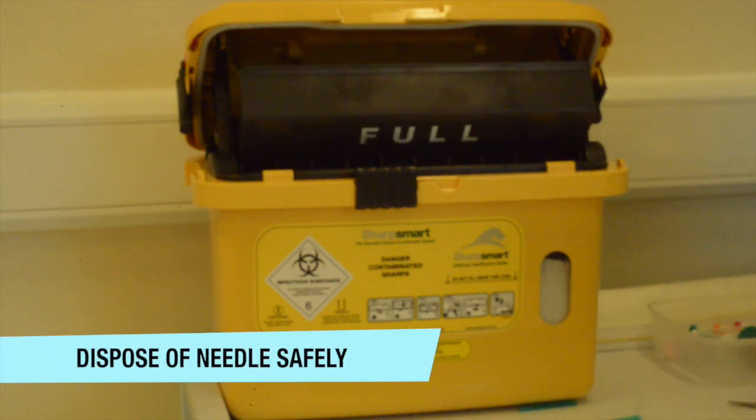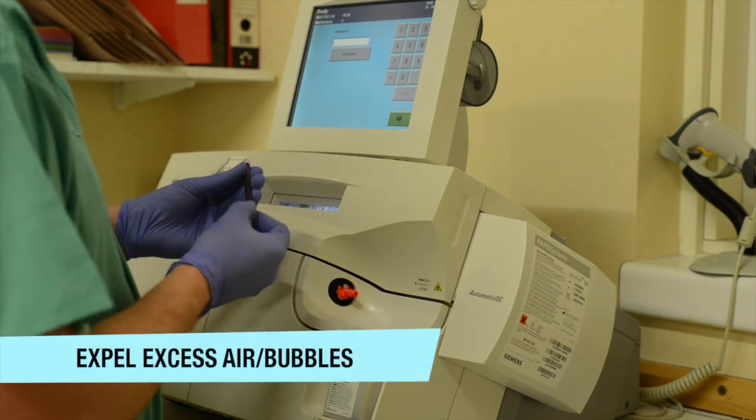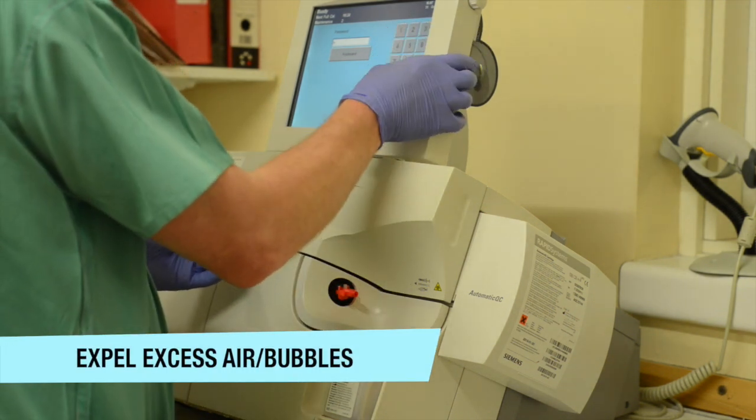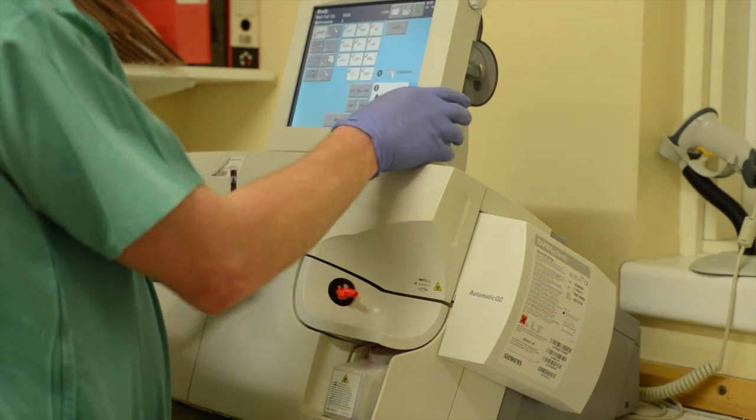Ensure that you have disposed of your sharps safely before taking your sample and analysing it in the ABG machine. Ensure that you have expelled any excess air using the filter cap provided in the pack.